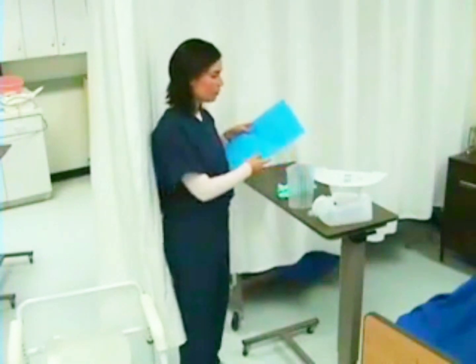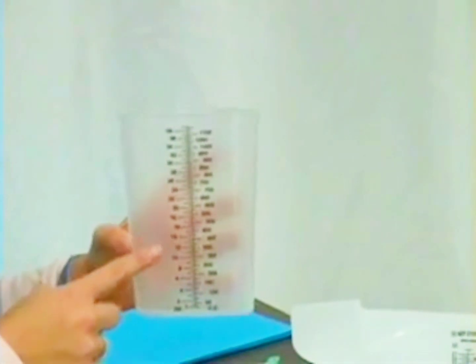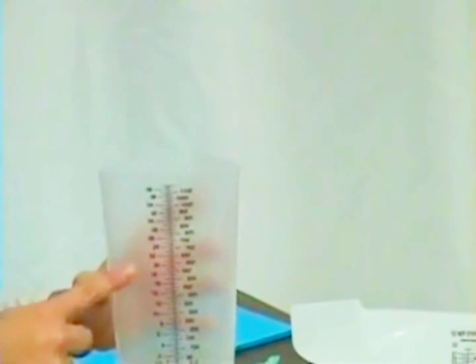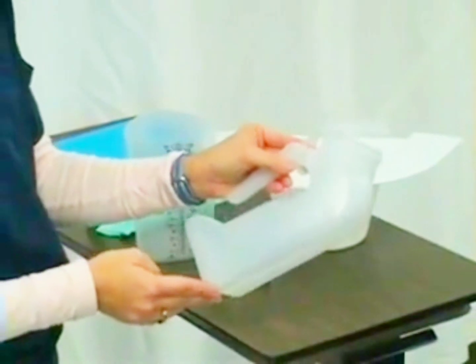I need to have an absorbent pad to place under my patient for removal. This is a graduated cylinder that I will use to empty the urine from my drainage bag and measure it before I remove the Foley catheter from my patient. If I have a male patient, I want to give my patient the urinal so that he can use this to measure his urine after the catheter is removed.